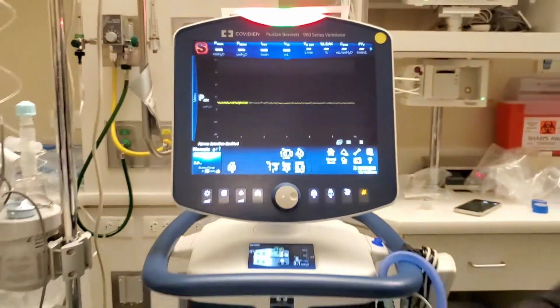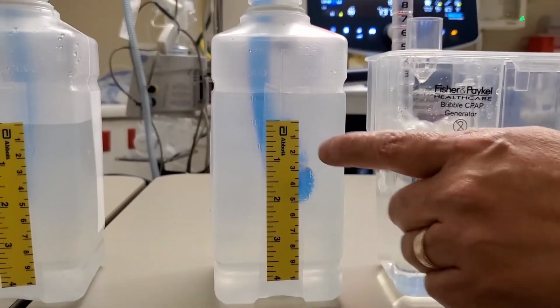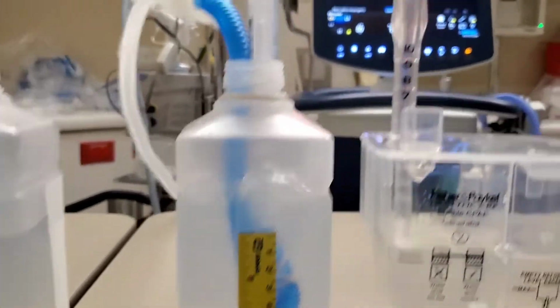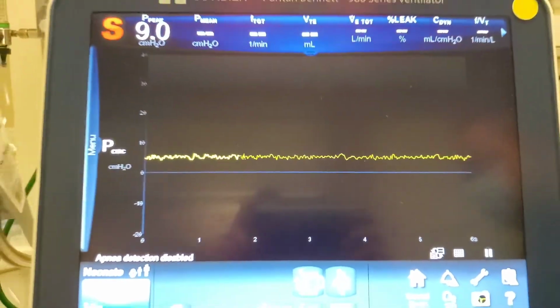And then from there, we're going to switch over to this. Now here I want you to focus in really tight. There's a curve. We've taken this and we put a curve in it. And so we're going to switch over to this one. And then I want you to see the fluctuation. So the fluctuation there is just a little bit more.